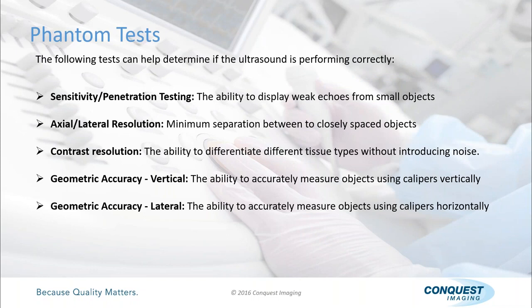So here are some of the phantom tests that we use. They call it system sensitivity and/or penetration testing. I'm not sure how they get the term sensitivity. What you're looking for is penetration testing. That's really what you're looking at. Penetration testing is required on every single probe.